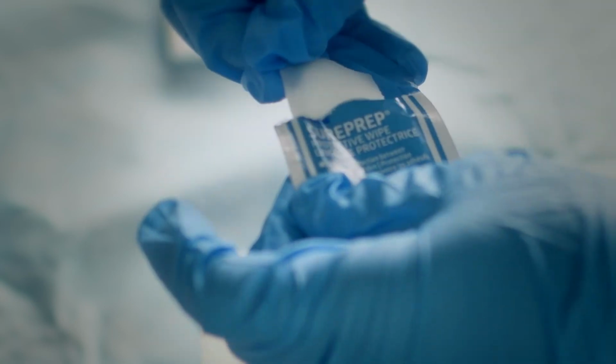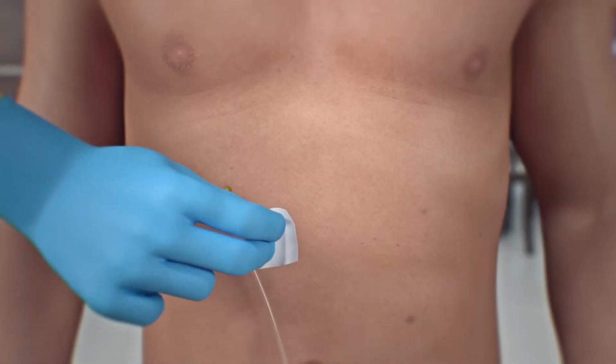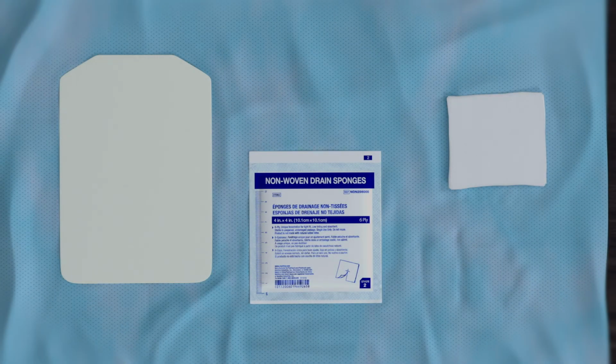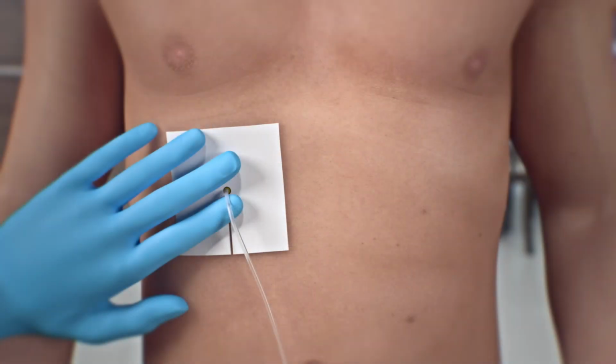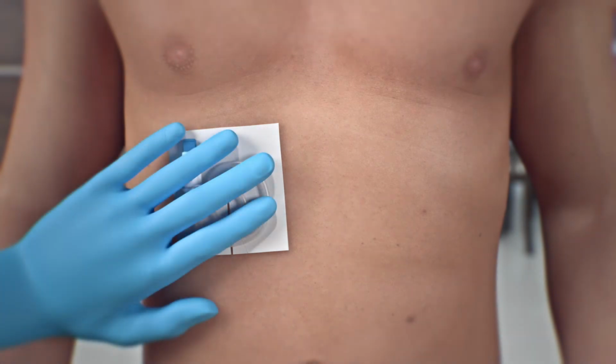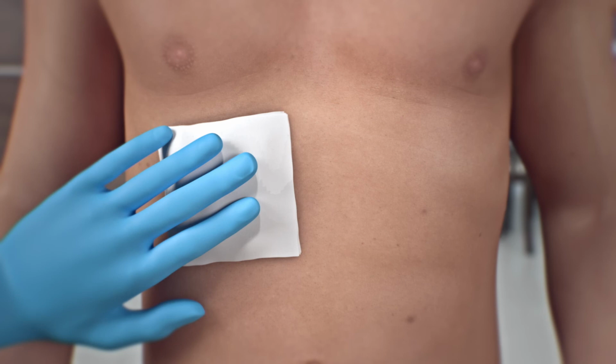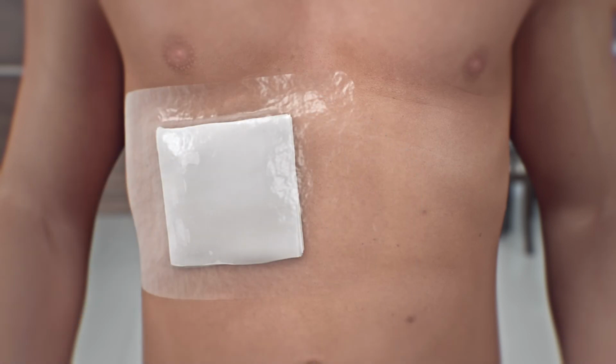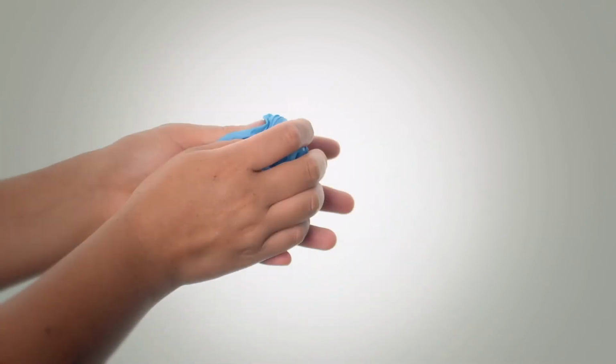Open and remove the skin prep pad from its pouch and wipe the area of the patient's adhesive dressing site. Allow to dry for approximately 30 seconds. Use the supplied redressing kit to redress the patient's catheter insertion site. First, place the split gauze around the catheter exit site. Coil the catheter and place up to 4 pieces of gauze over the catheter. Carefully cover the entire catheter site and gauze with the adhesive dressing. Remove gloves.